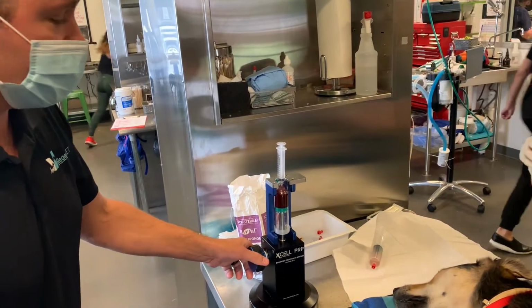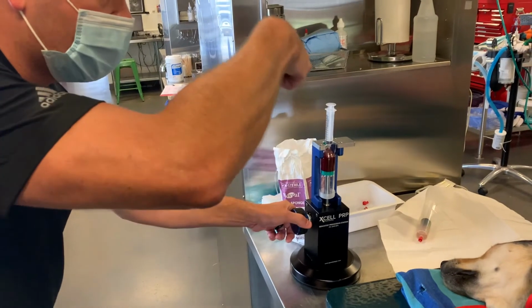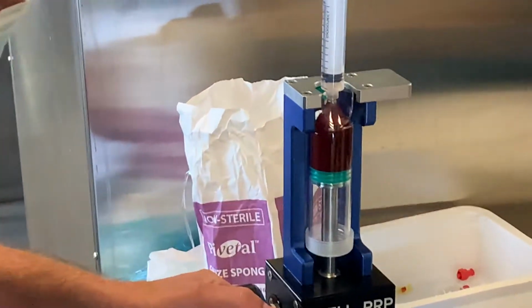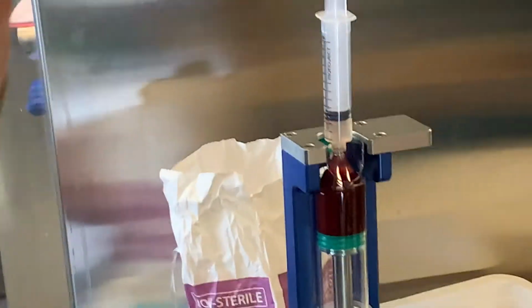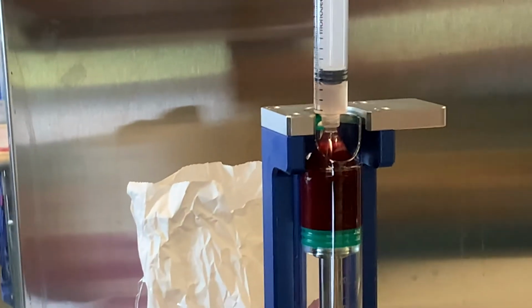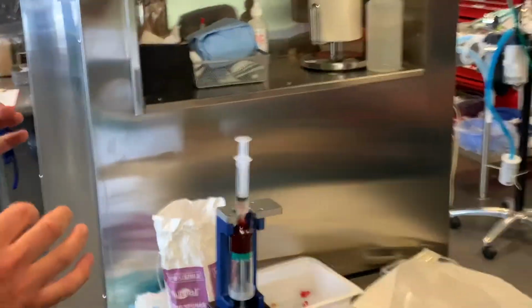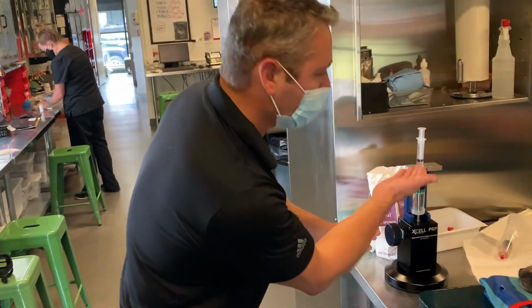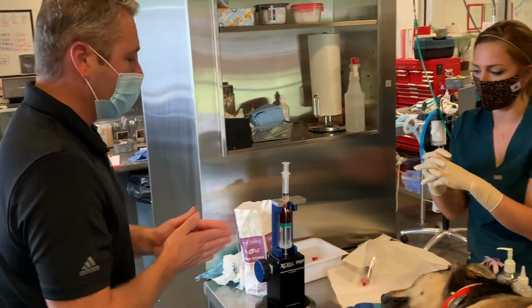So this is kind of the magic of it. The reason you don't have to do a 2 spin is because we're pushing it instead of trying to take out the red blood cells first. So you can see the buffy coat kind of start to slide up the cone there, and we're going to stop when we get the buffy coat in, or when we see a little poof. Oh, yep. There it is. So this is a leukocyte poor sample. If we wanted a leukocyte rich, we would just turn it a little bit more until the buffy coat goes in there. It looks kind of like a booger going in there, and then you're done. Okay. But it's going to be more.